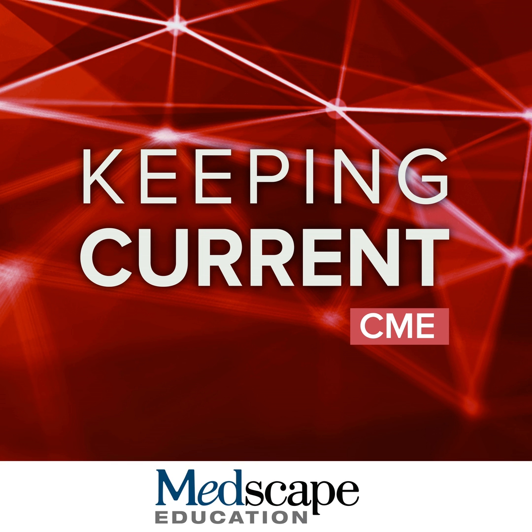So first of all, as many of you know, the cardiac MRI exam consists of multiple techniques. This is the beauty of MRI. You can combine cine imaging with perfusion imaging, with delayed enhanced imaging, and you can also do angiography at the same time. And you can look at anatomy and morphology with dark blood imaging.